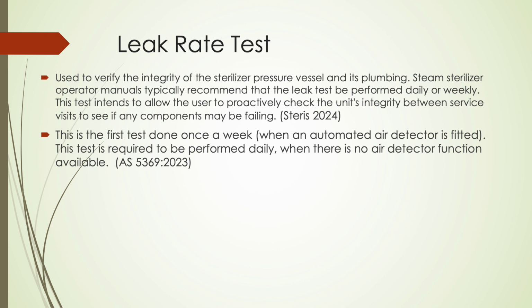Why? If the sterilizer has a high leak rate result, the Bowie-Dick test may fail because the vacuum needed for air removal and steam penetration will be compromised.